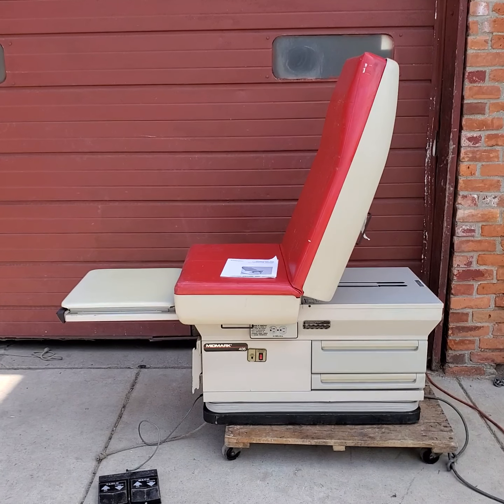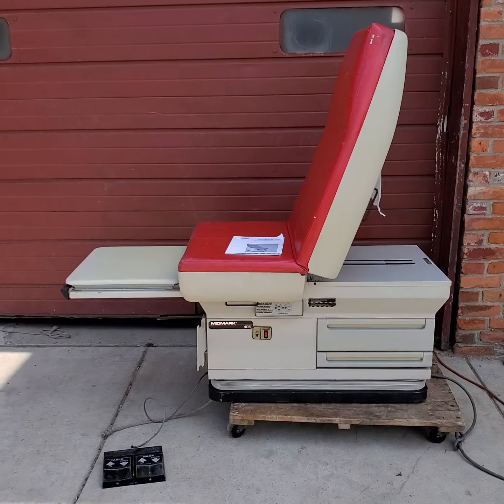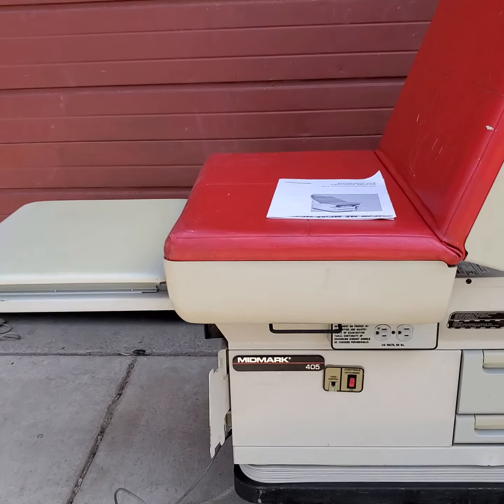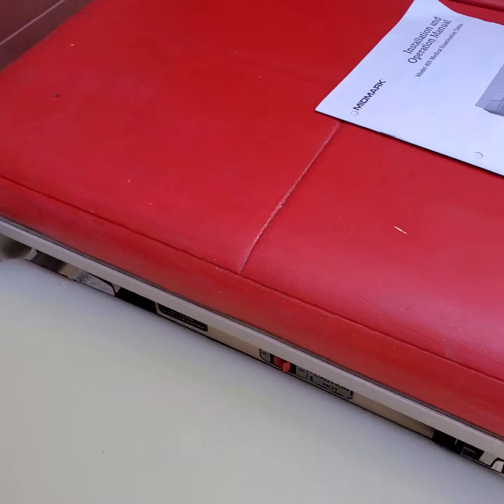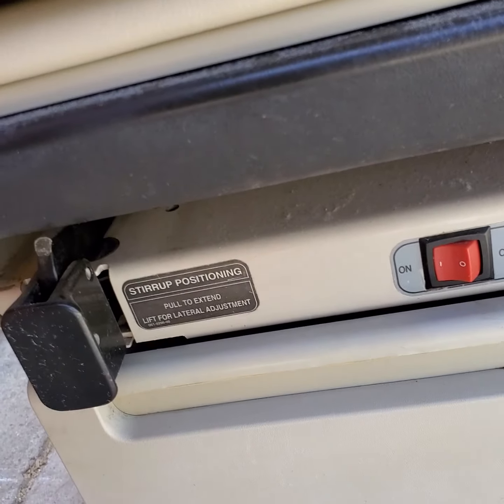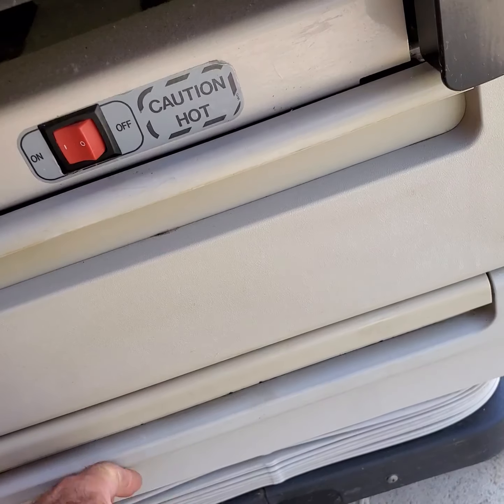Here we have a wonderful operational condition Bidmark 405, and it is working perfectly. It does come with the footrest, it comes with the heated drawer, and it does come with the drawers as well.